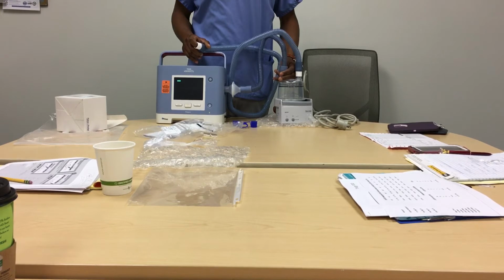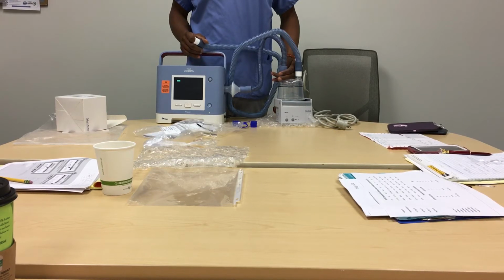If you have them on HMEs, how often do they have to change them? I would say daily. I will not take that chance. Because I know in the inpatient arena now, we have those HMEs, they don't recommend changing them except every 96 hours, unless they're totally soiled. So I didn't know what's happening in home care with that.